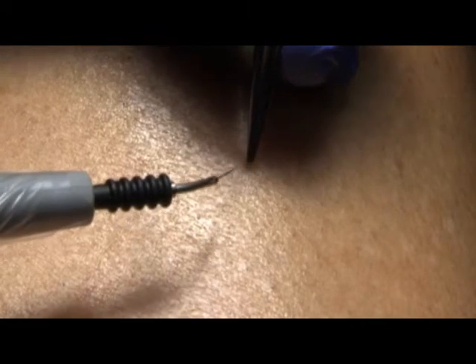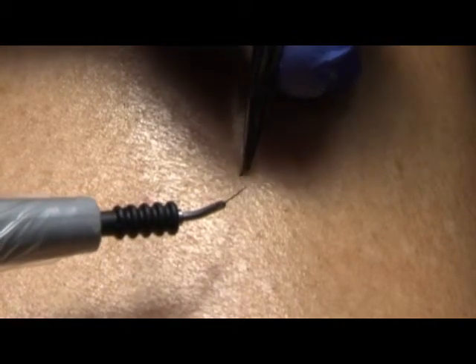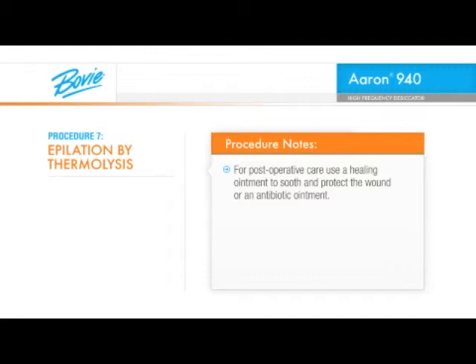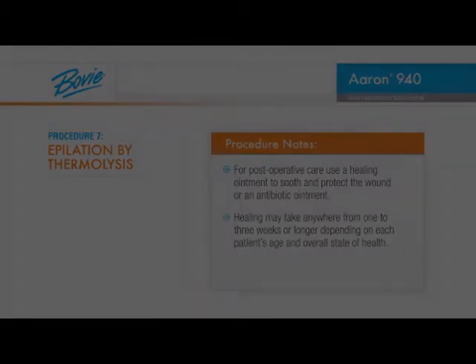If keeping the handpiece steady while depressing the activation button is a concern, an optional BOVI A803 foot switch is recommended for activation. Test the hair with a pair of forceps. If it doesn't remove easily, try a slightly higher power setting or a longer activation time. For post-operative care, use a healing ointment to soothe and protect the wound or an antibiotic ointment. Healing may take anywhere from one to three weeks or longer depending on each patient's age and overall state of health.